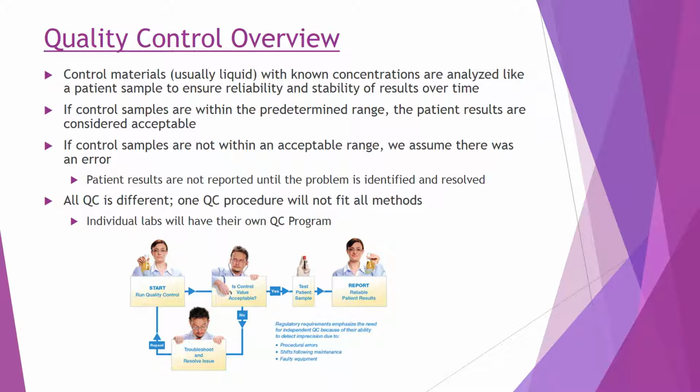And for this, patient results should not be reported because we cannot trust those results. So back to that question, can we report that with certainty? No, we can't. So individual labs will have to write their own QC program since all of these methods are different.